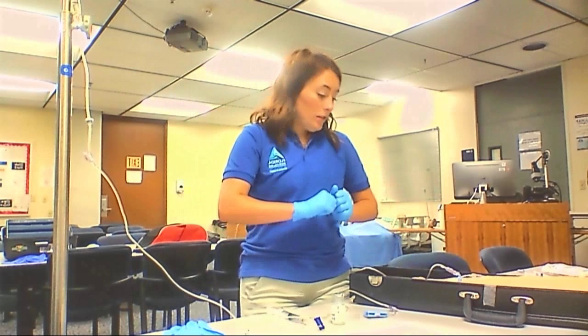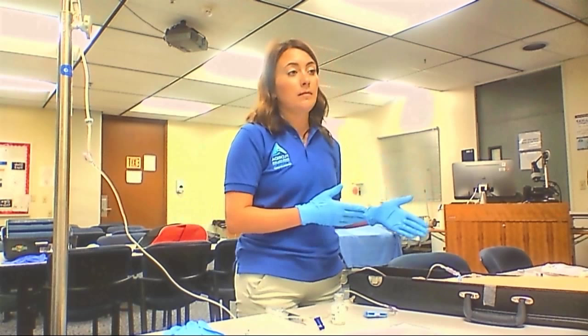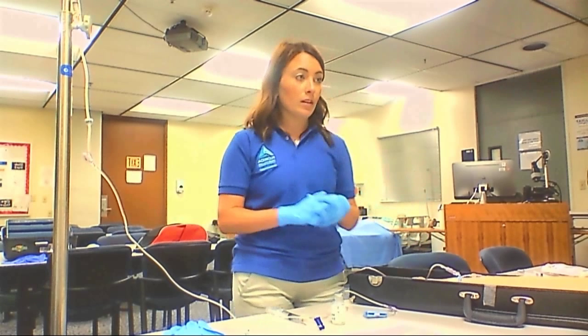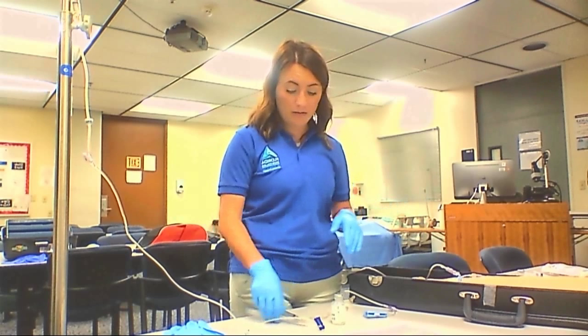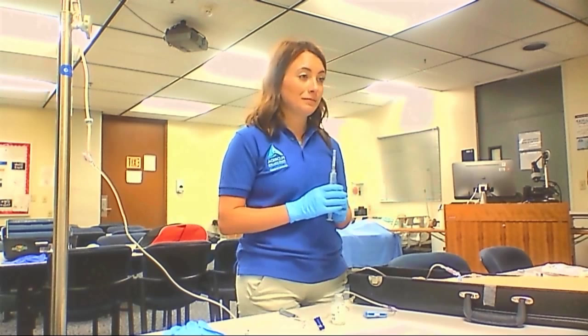After the infusion is over, I'll disconnect the tubing using aseptic technique, and then apply a new sterile needleless device for the next administration. Again, I'll dispose of any needles in the sharps container as needed. I should have flushed my line. Okay.